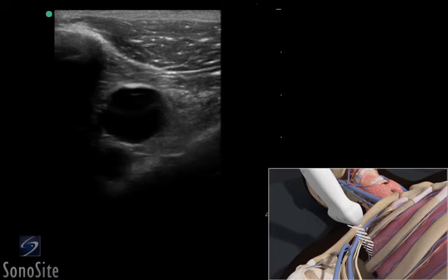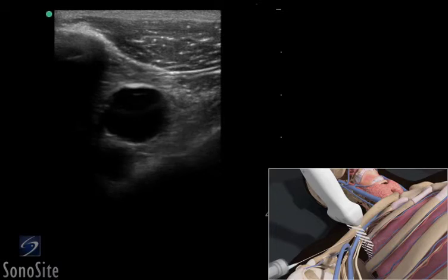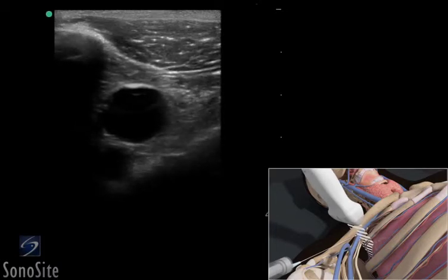Adjust the transducer so it is centered over the vein. Follow the needle entry by slowly sliding the transducer in the direction of needle advancement. The needle will appear as a small bright hyperechoic dot.